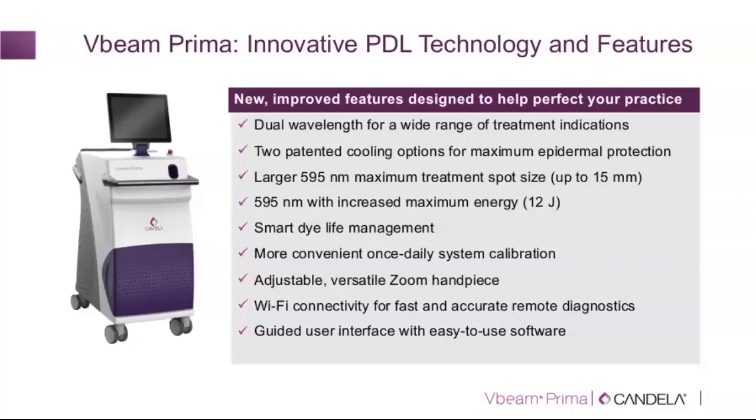There are doctors who are also very used to DCD, cryogen dynamic cooling device, and therefore they can simply continue using the DCD. But from my personal experience, using the Vbeam Prima now with the two different cooling methods, I prefer to use the contact cooling in patients who have very sensitive skin and particularly do not like that spraying required in the pulsation. And they find the contact cooling, as there is also a gel that is applied for gliding, more comfortable. So for the patient's comfort, I tend to use that.